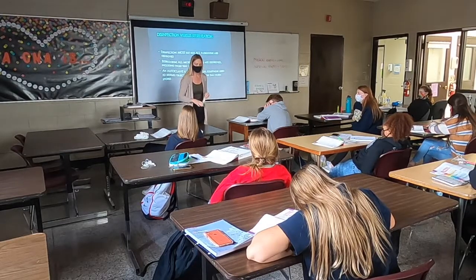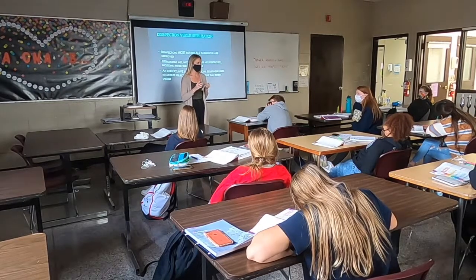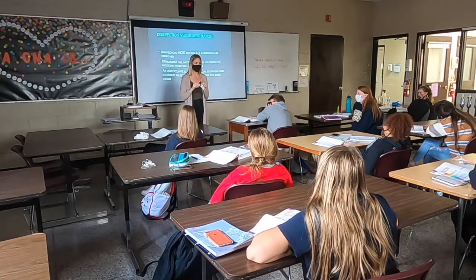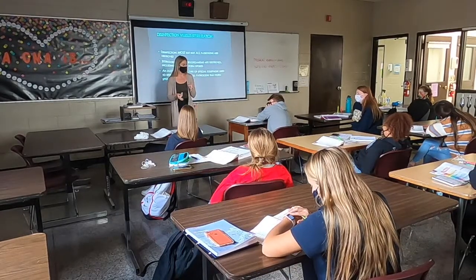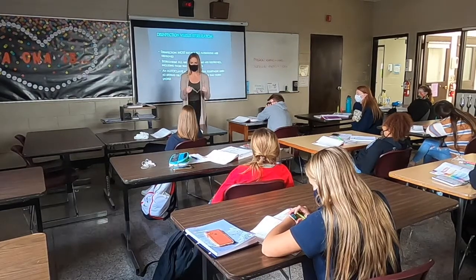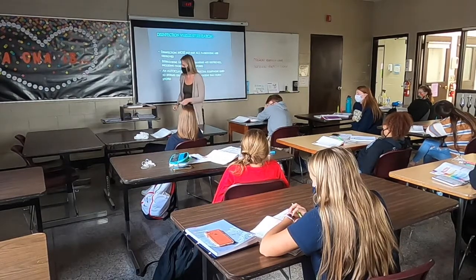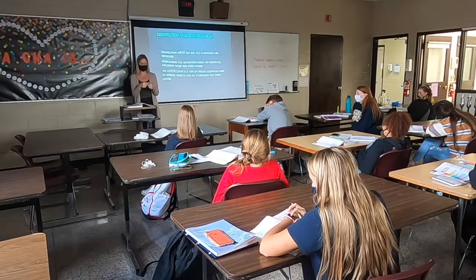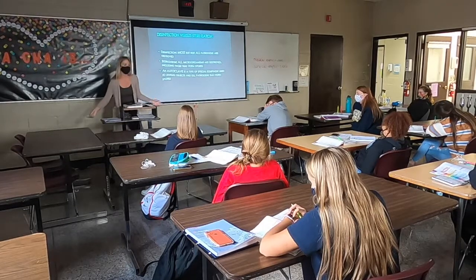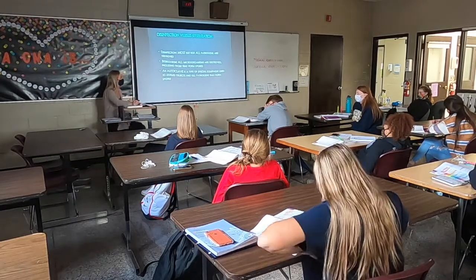Okay? Sterile means free of all bacteria. So how can I put this piece of equipment onto the sterile field sterilely? Just like this. I didn't touch the piece of equipment, the package is still in my hands, and I just dropped it right onto the sterile field, and that's okay. So that is how we would add any piece of equipment onto a sterile field without contaminating it, okay? Throughout the year, I'll get more things that will open sterilely, and we'll practice different ways to assist in sterile procedures, and of course learn how to put on sterile gloves. That'll come a little bit later in the year.